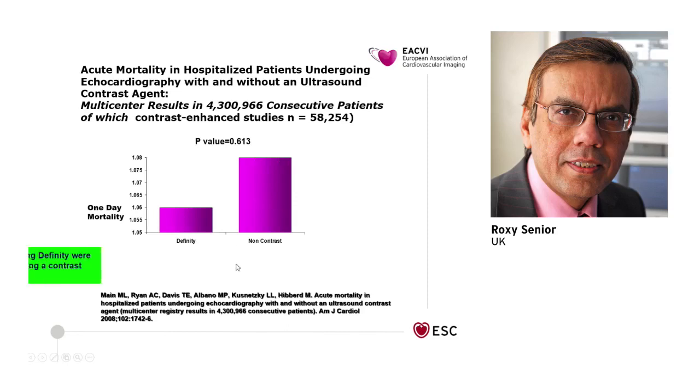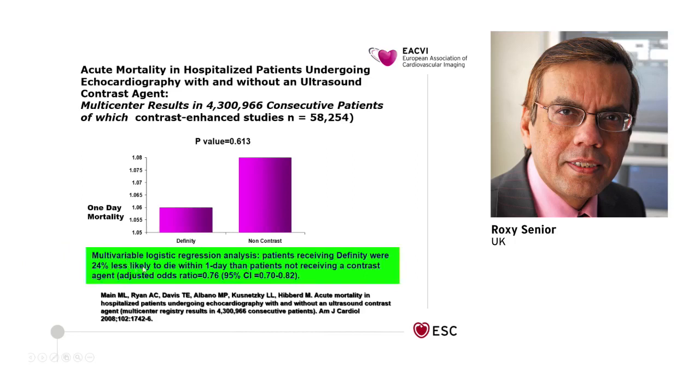Now, if we look at the difference between the two groups after multivariable logistic regression analysis, taking into account all the other risk factors, contrast echo actually resulted in 24% less likelihood of dying within one day than patients not receiving contrast. And this is, as was alluded to by Bernard before, mainly because, as also seen in the previous study, contrast echo improved the management of the patient by arriving at the correct diagnosis versus those patients who did not undergo contrast echocardiography, and that resulted in improvement in outcome.